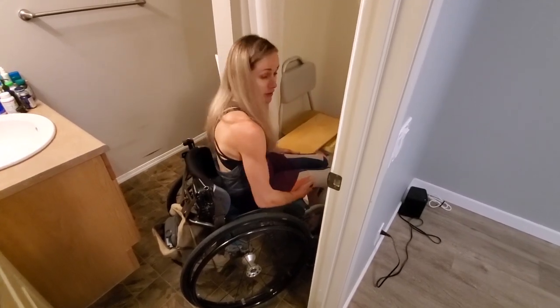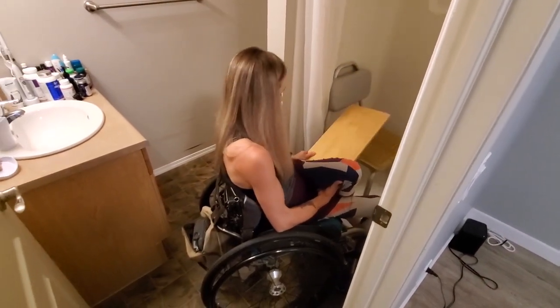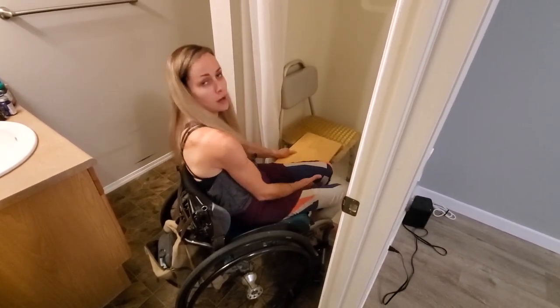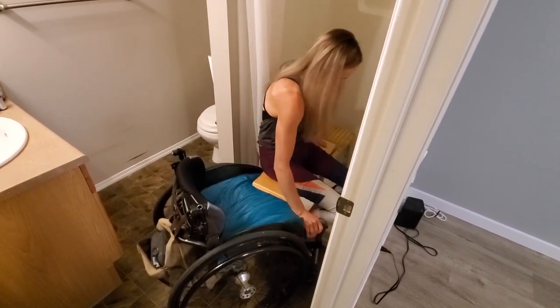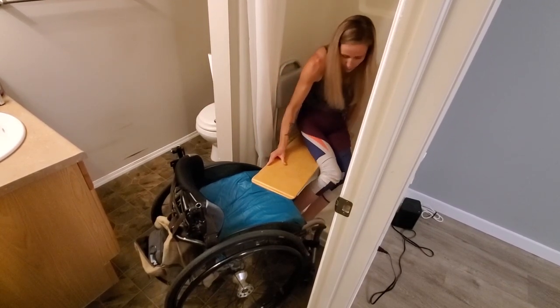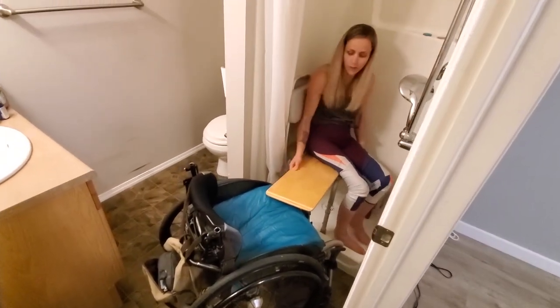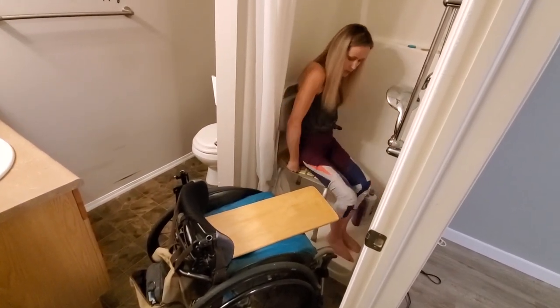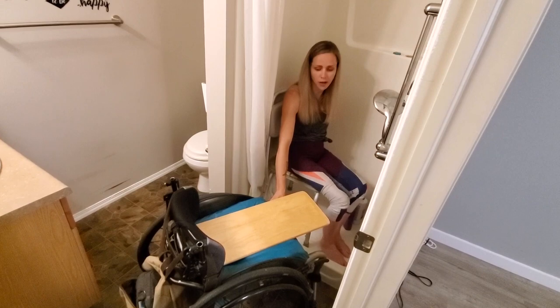So I scooch my butt to the edge of my seat, lift up my leg, and slide the transfer board under my leg and my butt so that it's on my seat cushion. Then that's it — just slide that way — and then I lift up my leg to take the transfer board out and get on my seat.